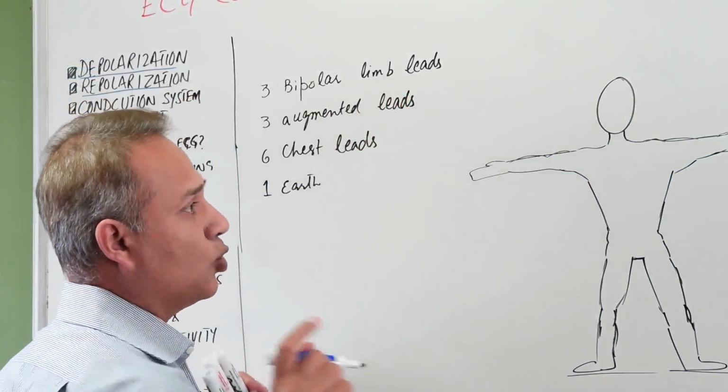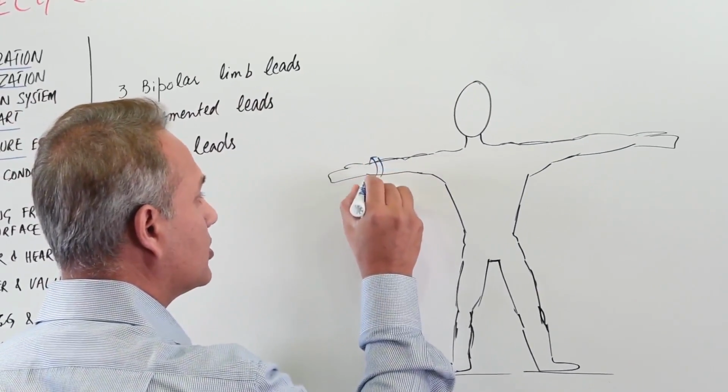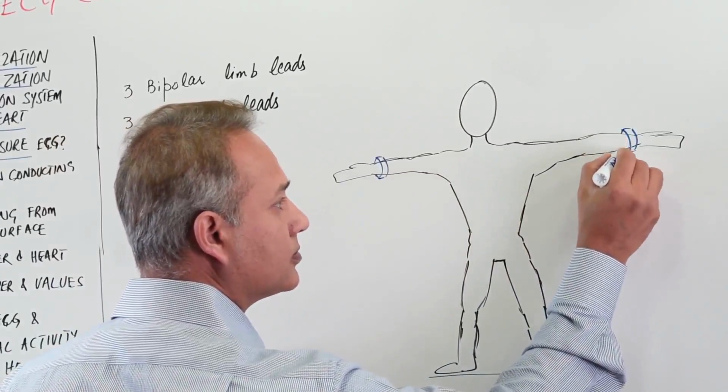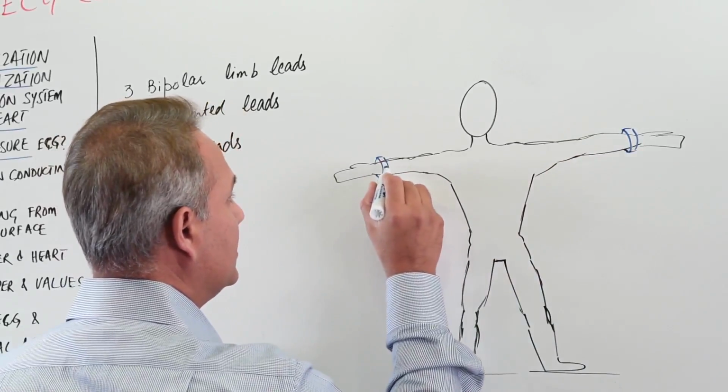So lead number 1 is attached to the arms, and so this is the lead number 1.